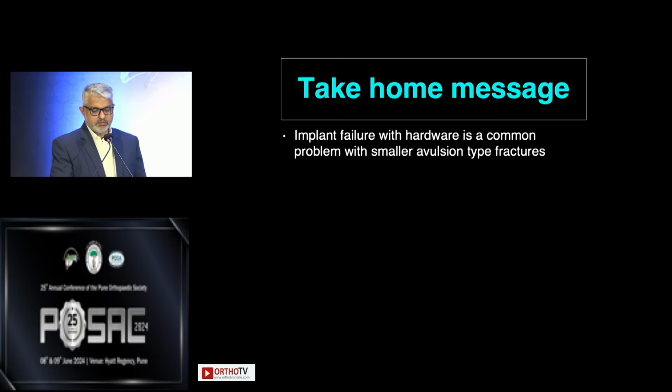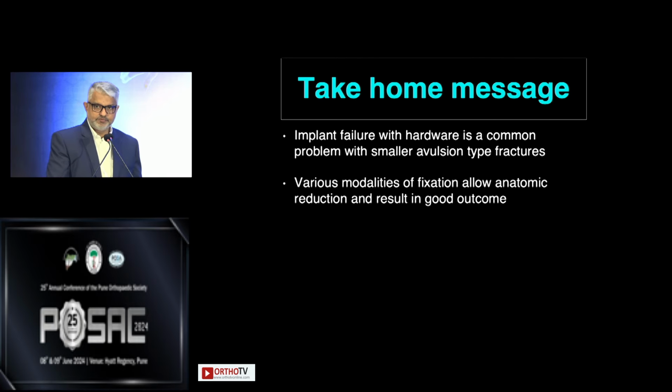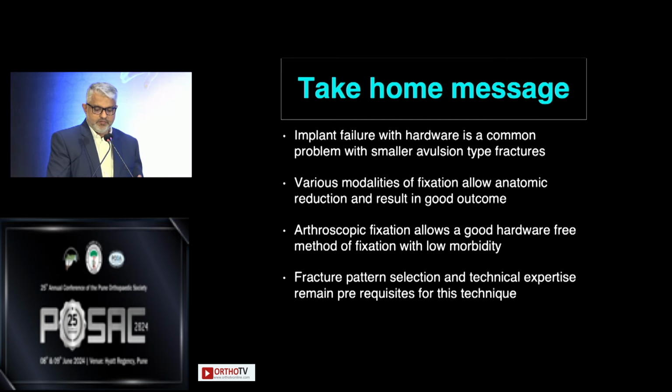So if I have to summarize this, implant failure we know in greater tuberosity fracture is a big problem. Various modalities of fixation allow for a good anatomic reduction. Arthroscopic fixation allows a good hardware-free modality of fixation. Fracture pattern selection and technical expertise remain prerequisites for this.